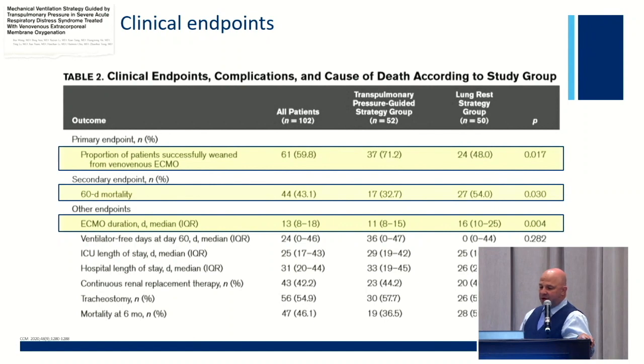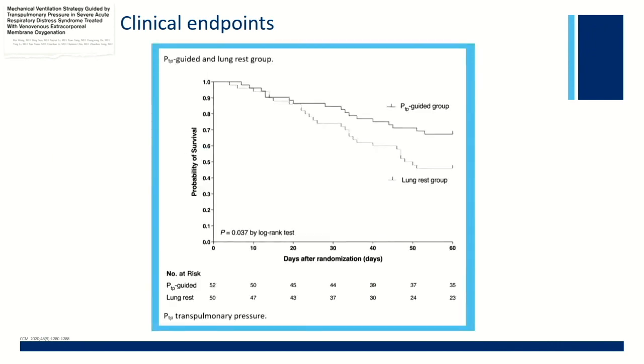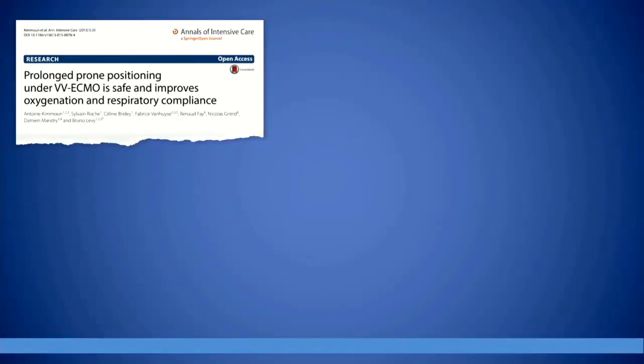As you come to the outcomes, you can see here that the outcomes were better. I'll let you read the slides because I got a 10-minute warning over here, but the esophageal pressure guided group performed much better, to a statistically significant difference, right? And so you get to this idea, this is just a Kaplan-Meier curve, that they survived. They got cannulated, and they had shorter runs because we personalized that.